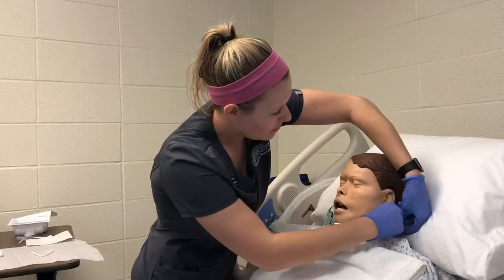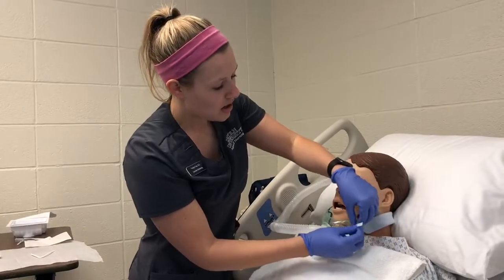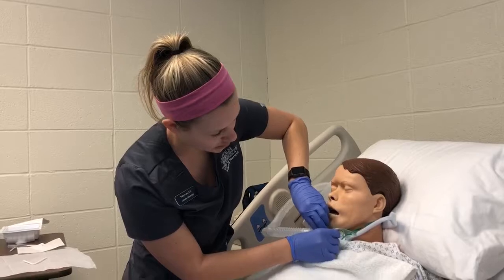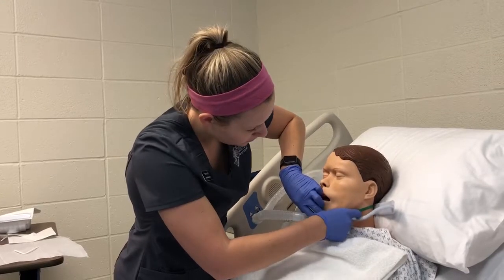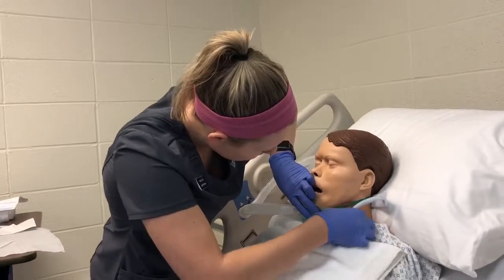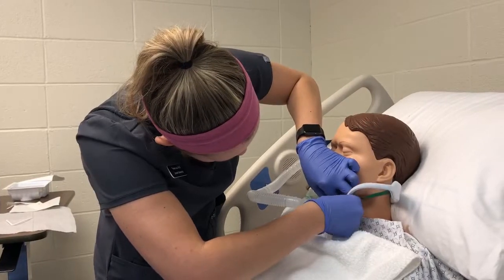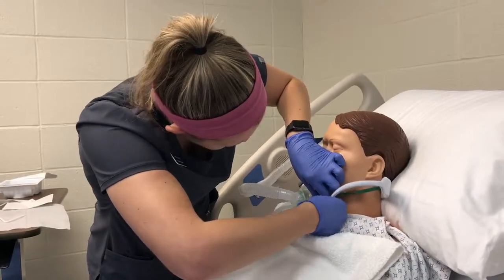So you may have to cut these because they may be a little bit too long for your patient. For instance, this one's a little bit too big for this mannequin. So what I would do is you would thread the trach tie through the hole on this cannula, and while you're making sure you're holding onto it. So this just kind of comes out, and then you can put a new one on, and you just thread it under there through the hole. Making sure you're keeping the trach intact, or in place. And you may need a partner, because sometimes this is a little bit difficult.